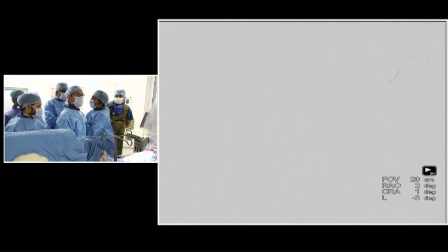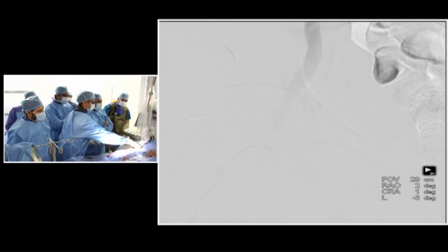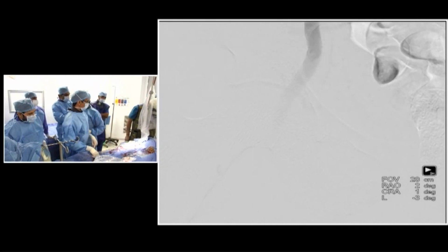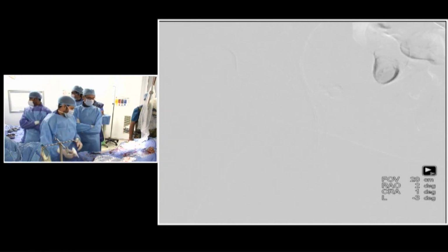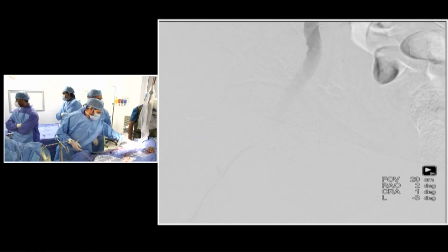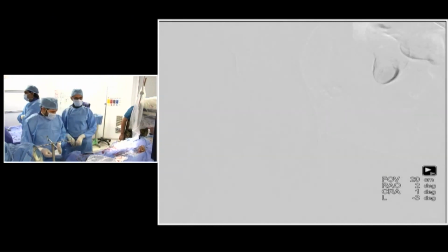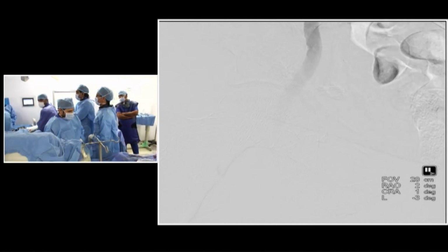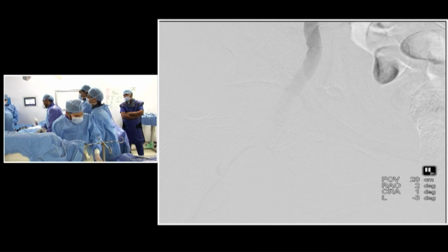Let's focus on the filters, please. And then we also do a cerebral, the neurological assessment before the patient leaves the cath lab. Otherwise, there is no benefit of doing a conscious sedation TAVI. So Prashant is going to talk to her and just ask her to move all upper and lower limbs. It's okay. I think sometimes it's difficult to find, we understand, but still I think you showed the Sentinel filter deployment very well. Congratulations to the entire team, great demonstration.